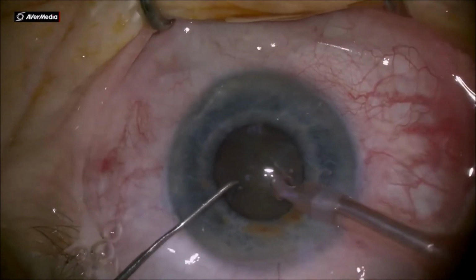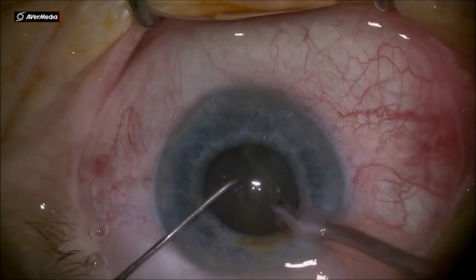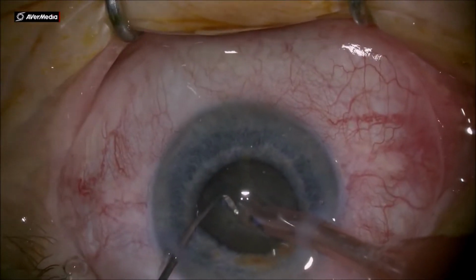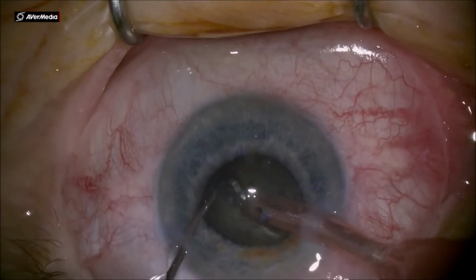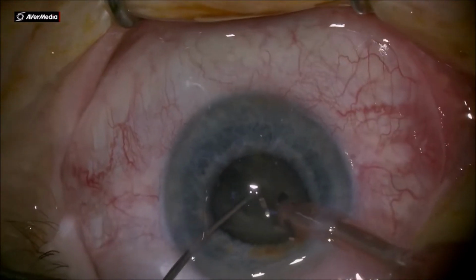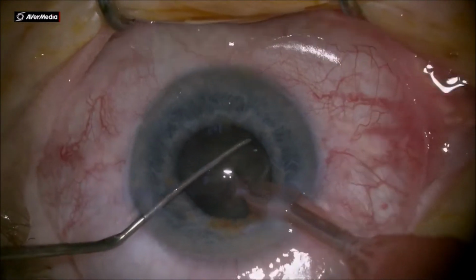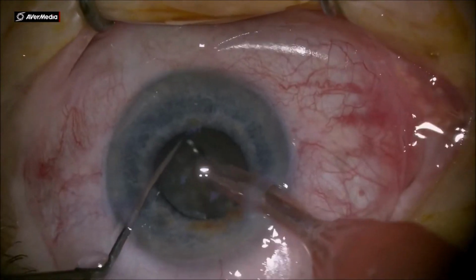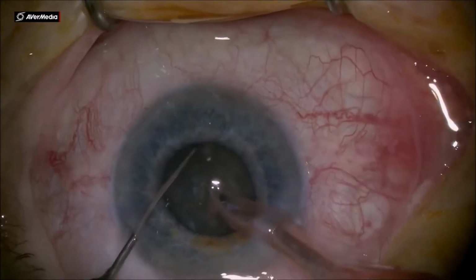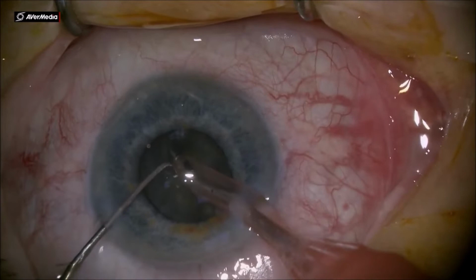the middle of the pupil, so I will have a deep trench in the middle, and that will make cracking of the nucleus easier. Notice the fact that I rotate the chopper a little bit to have as much contact with the nucleus when I do the cracking, and going deep inside the trench when I pull the instruments away from each other, and making sure the crack is all the way through the posterior plate in this leathery case and make all the difference.